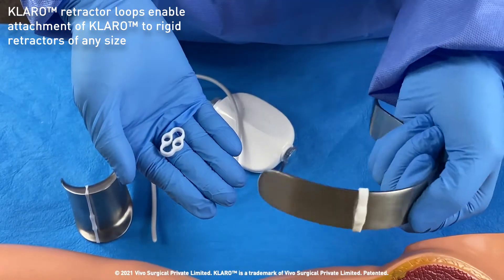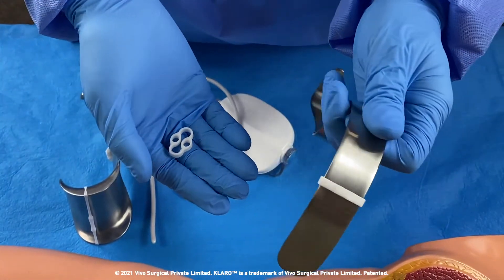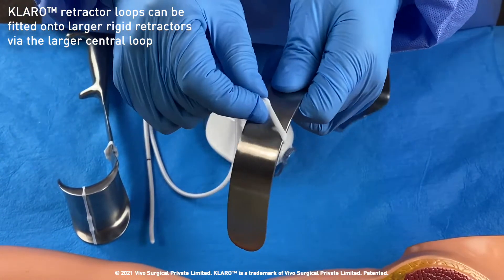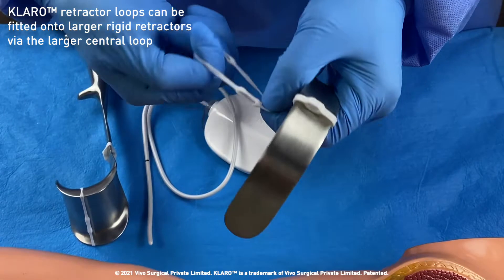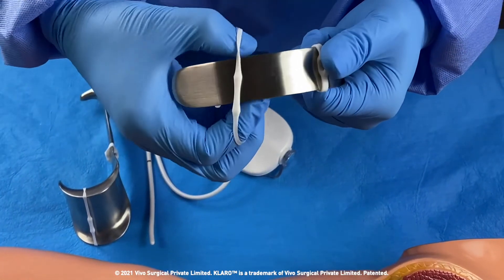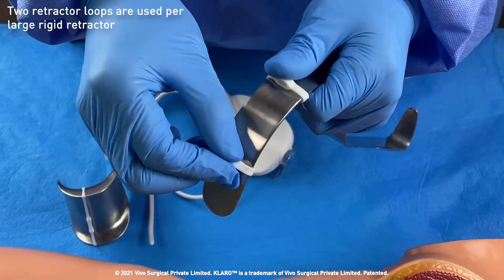The retractor loops can be easily fitted onto any retractor by insertion through the larger central loop. Two such retractor loops can be positioned along the retractor.